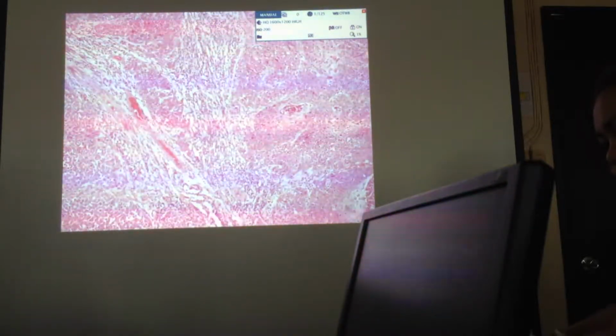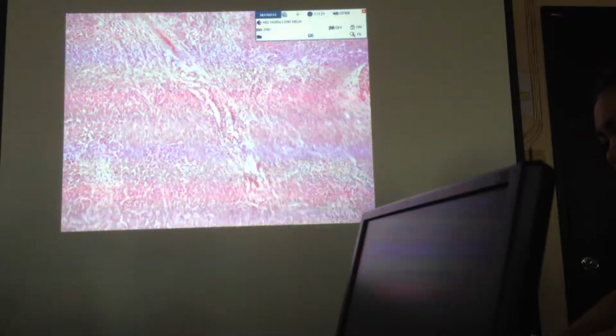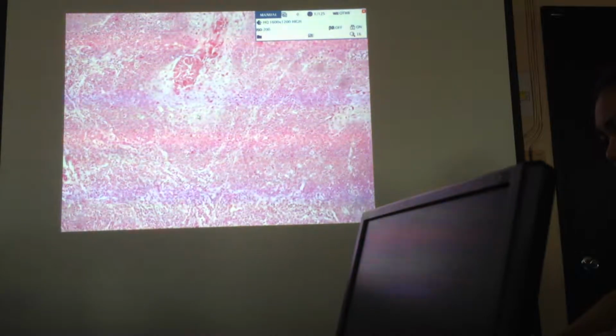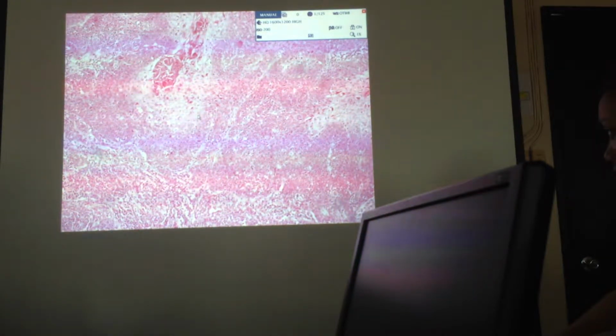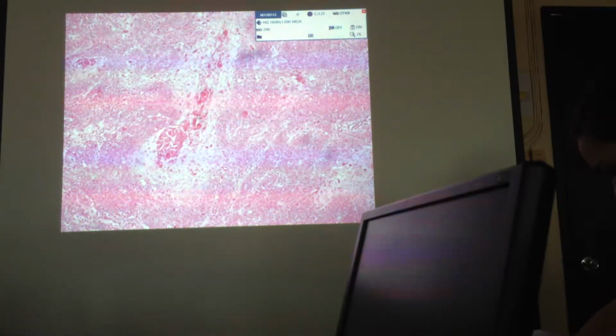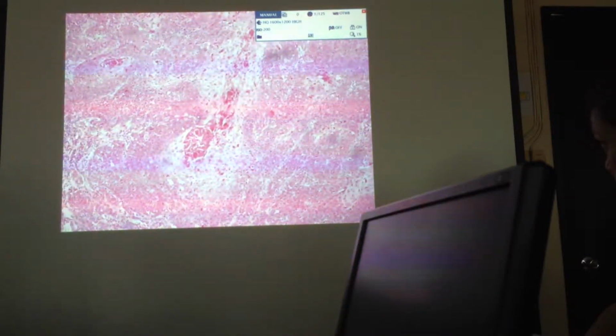And then the difference between a large cell carcinoma keratinizing and a large cell carcinoma non-keratinizing would be the presence of keratin pearl. Okay. So even if there's individual cell keratinization, if you do not see keratin pearl formation, then you will label it only as non-keratinizing. Okay? So kahit ito lang makita nyo, wala kayong makitang keratin pearl like this one, then you label it as non-keratinizing.